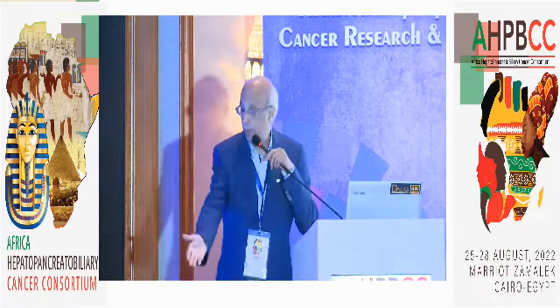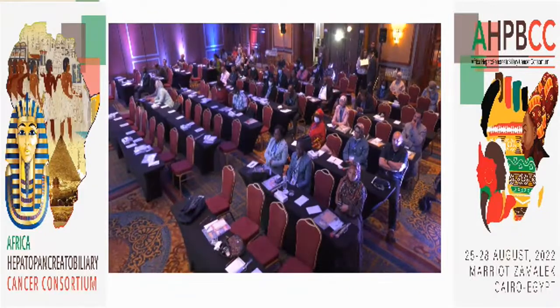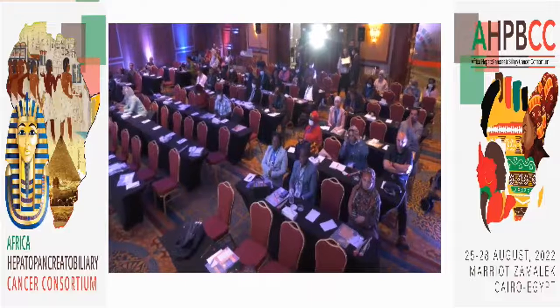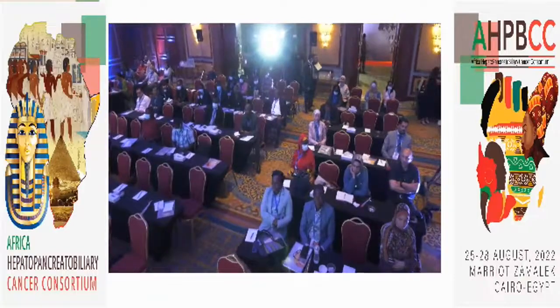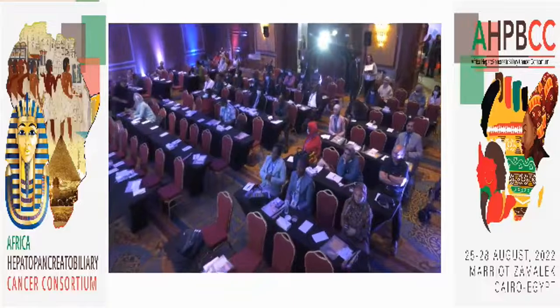Okay, please, we would like to try. We are going to follow the same steps. Dr. Yao started, so you go with station 1. Do you have any experience? Place the probe at the xiphoid process. Yes. Dr. Yao, you can join from the other side. Yes.